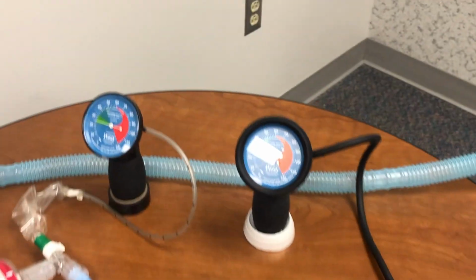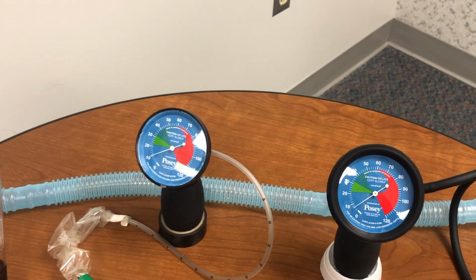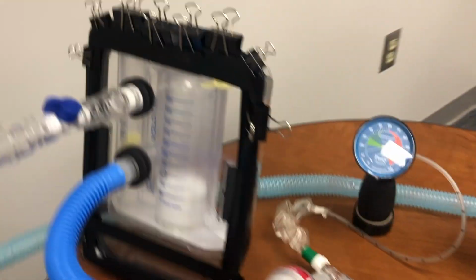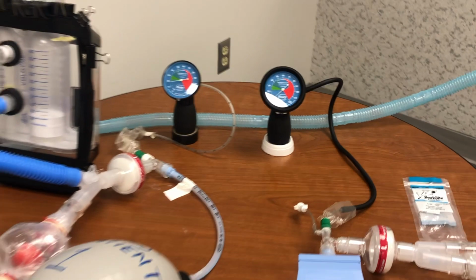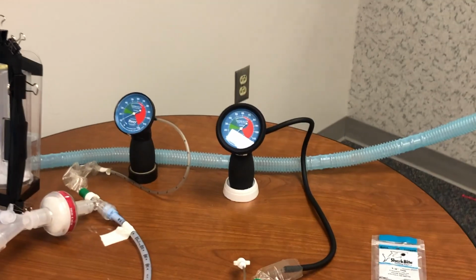We have taken this patient off the ventilator to bag and mask him. Nothing has changed on this patient. Let's see the volume. Not changed, or not significantly changed, I would say. There may be slight variation, but usually, and that is in extreme scenarios.